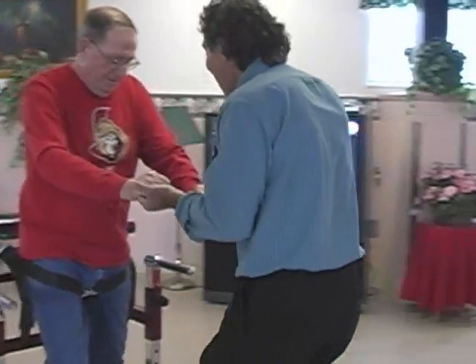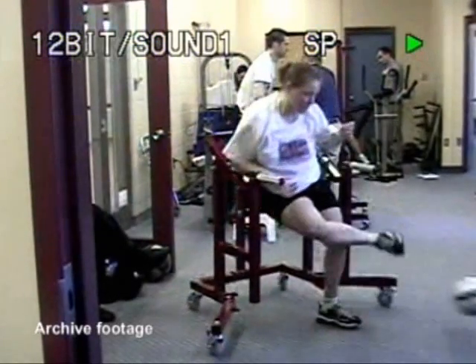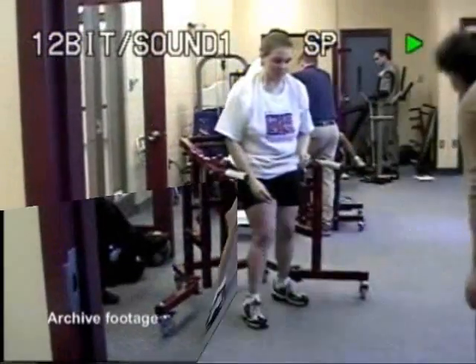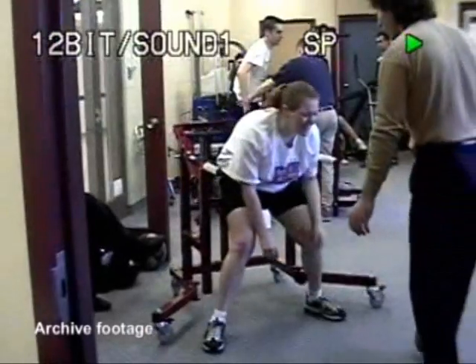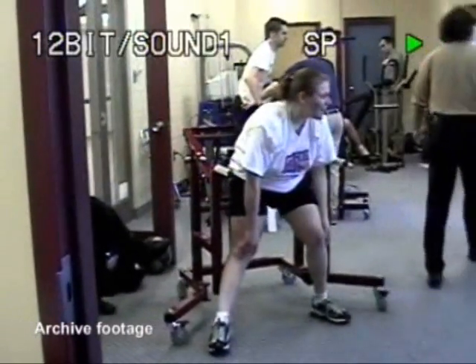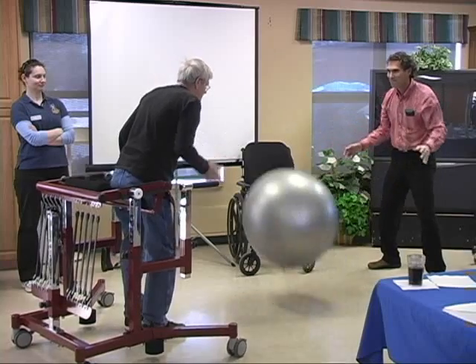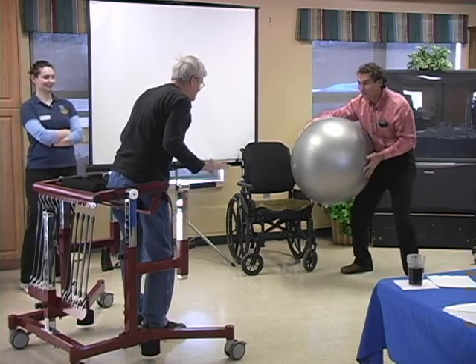It is optimal for gait training. Many falls occur because of an inability to recover from a stumble or a brief loss of balance. The opportunity to practice static and dynamic balance under more challenging conditions than simply walking is essential to achieve greater stability. The Bungie Mobility Trainer is designed to safely do exactly that.